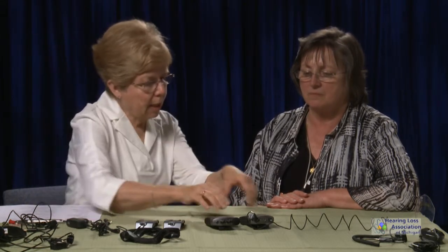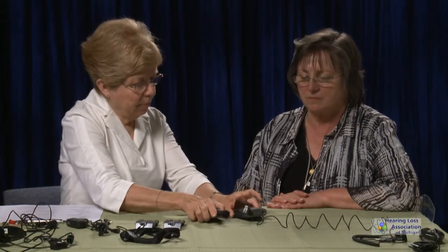One of the things I really want you to know right up front is that you can't always just put a piece of equipment on, turn it on, adjust the volume, and have it work comfortably for you. Sometimes what you need to do is also adjust the volume of your hearing aid or your cochlear implant. And sometimes even if you're connecting it to some other device, you have to adjust the volume on that device as well. Okay, starting out with the Motiva.